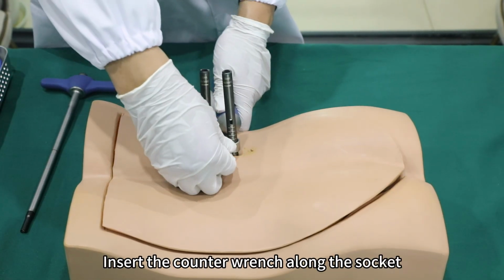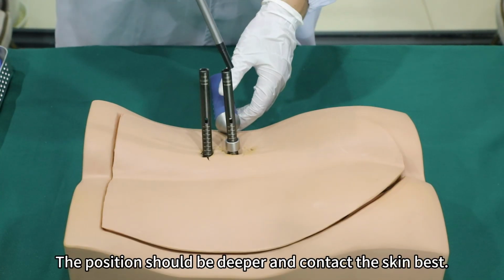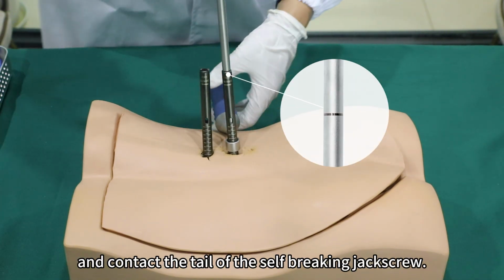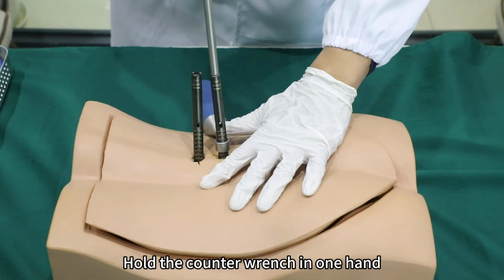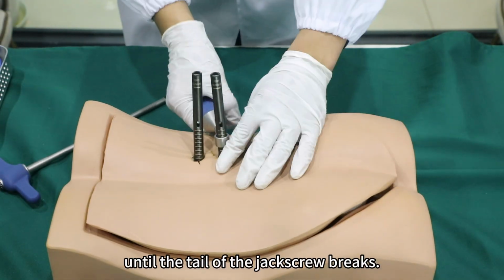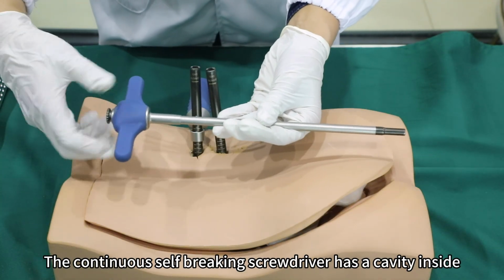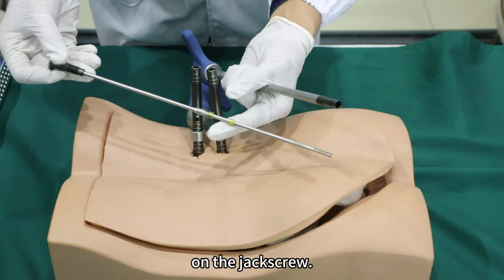Insert the counter wrench along the socket. The position should be deeper and contact the skin best. Insert the continuous self-breaking screwdriver into the sleeve and contact the tail of the self-breaking jack screw. Hold the counter wrench in one hand and the self-breaking screwdriver in the other. Lock the jack screw clockwise until the tail of the jack screw breaks. The continuous self-breaking screwdriver has a cavity inside, which can continuously carry out self-breaking locking operation on the jack screw.